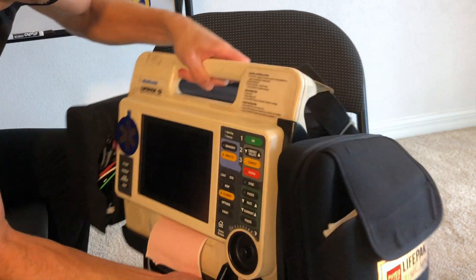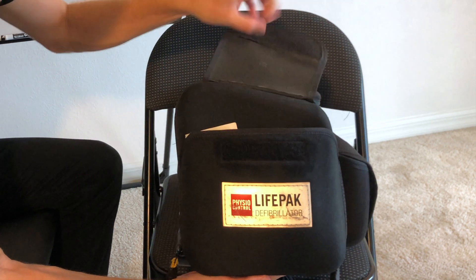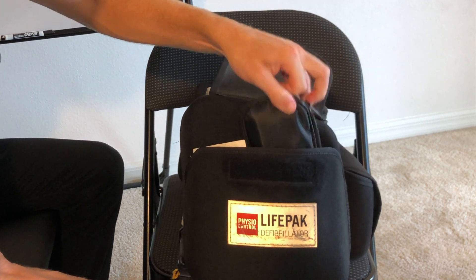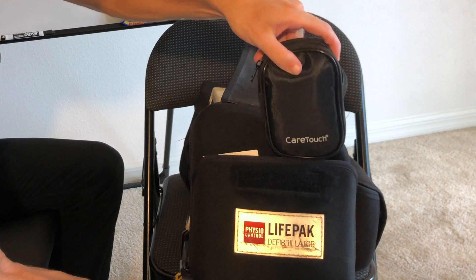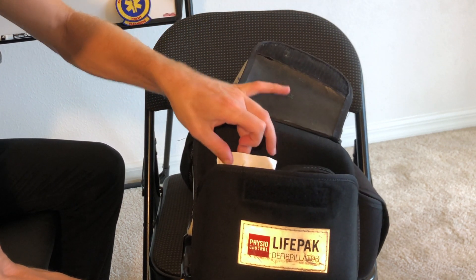So you can see I've got my leads in here, BP cuff, pulse ox. Now over here on the right side, I have a glucometer. And then whatever pack of electrodes I have open sticks out right here.